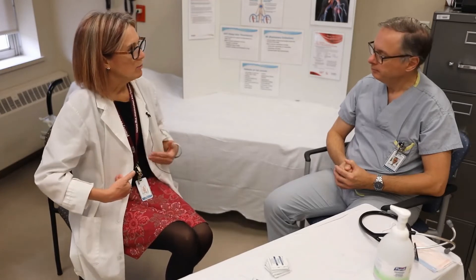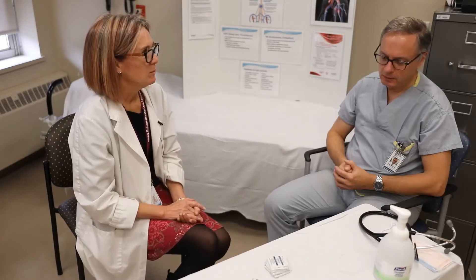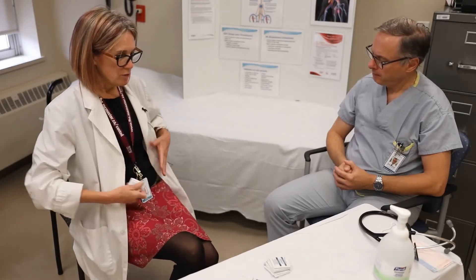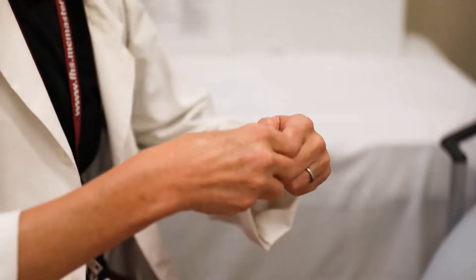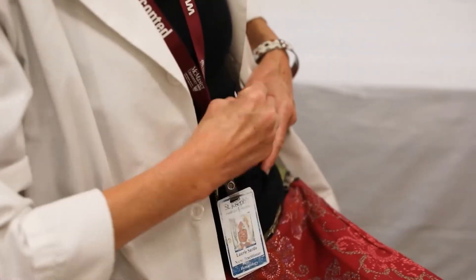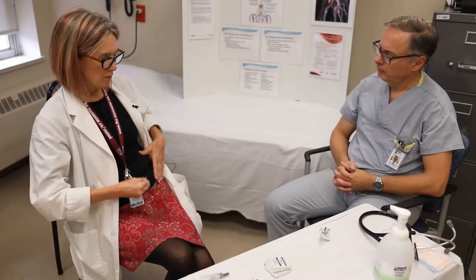The next step is getting the area ready where we're intending to inject. Did you want to do the top of your thighs or your abdomen today? I'm going to go with the abdomen — I've got more fatty tissue there. So we'll take an alcohol swab. I'll just review the technique with you before you go ahead and inject yourself — I'll choose the abdomen as well. You tear open the swab and then proceed to wipe a rather large area, because if you just do a little spot you won't remember exactly the clean spot you've readied for injection.